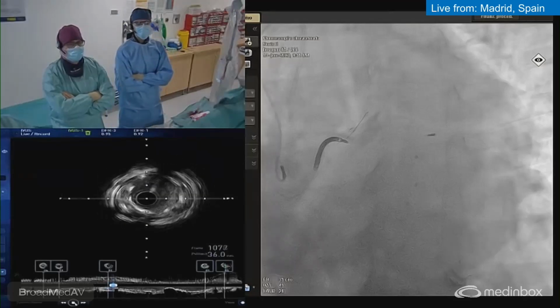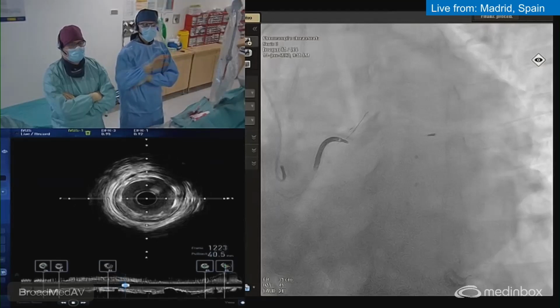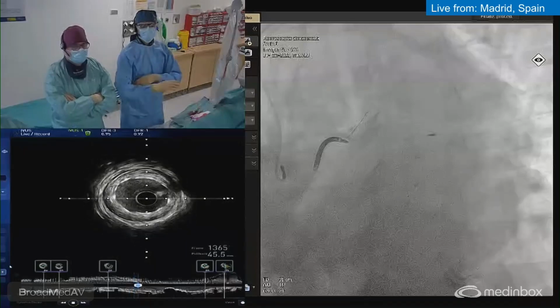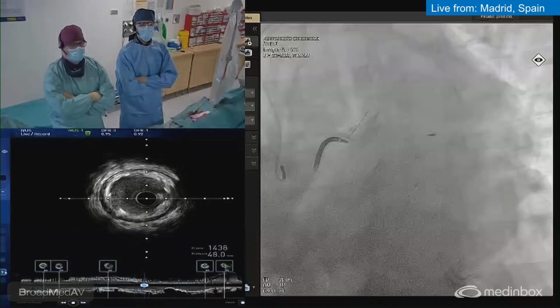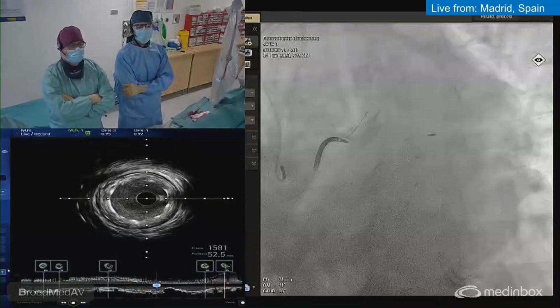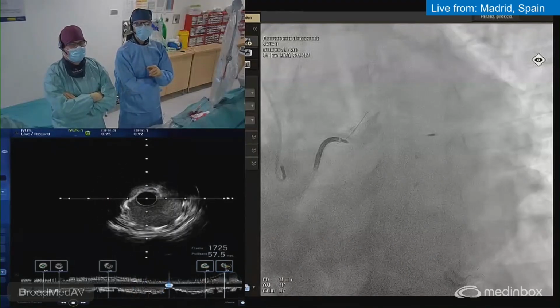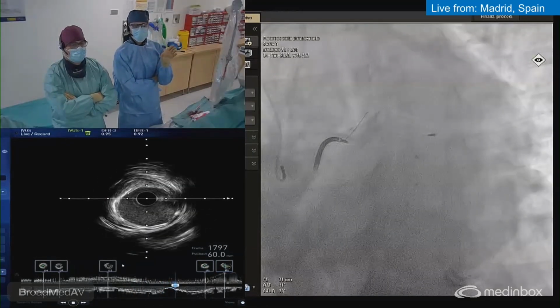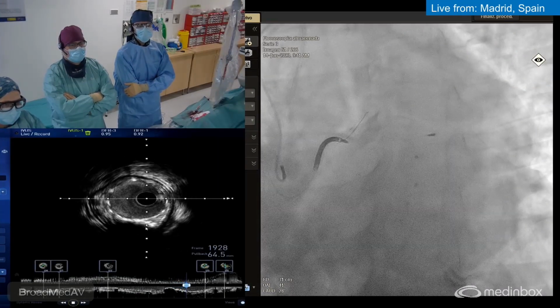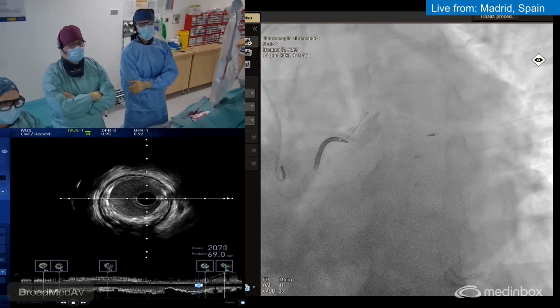In the longitudinal view, at the bottom of the IVUS, you can see some stenosis more proximally. And the most interesting part, we're going to see the whole run, but afterwards we can analyze it frame by frame, is the ostium. So this is the part that is probably a little bit underexpanded here. Here probably there is a calcified lesion. And now we are reaching the proximal part.